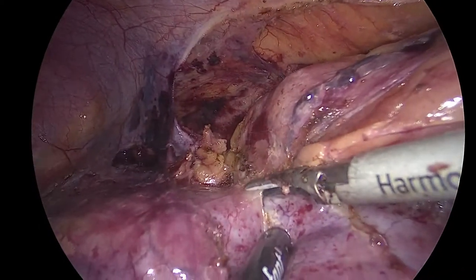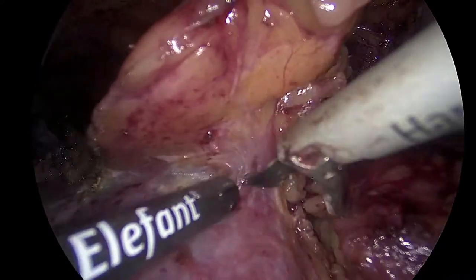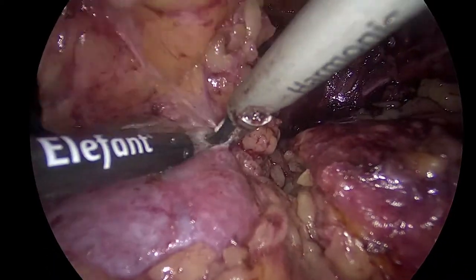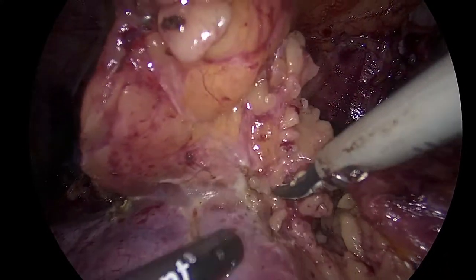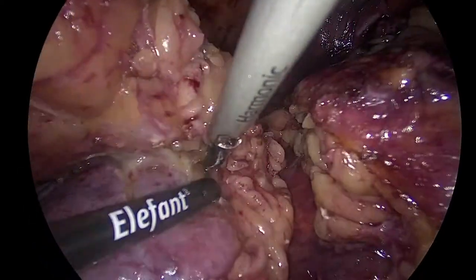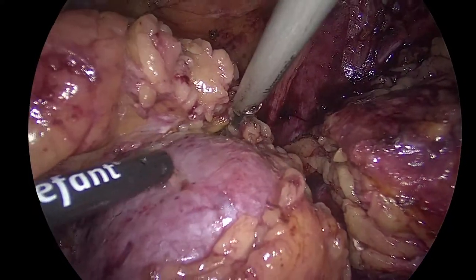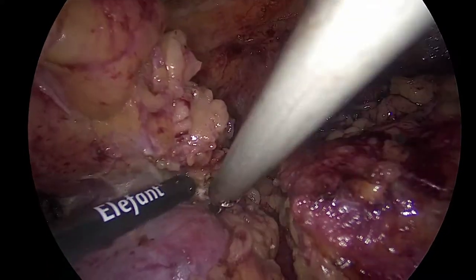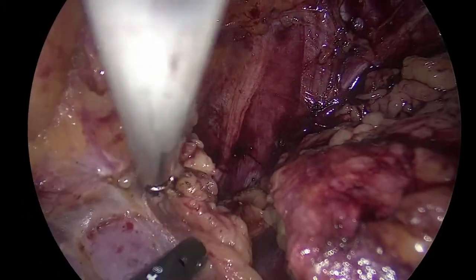Here, I've already started going. It's really very interesting. Watching you, how you use your left hand suction device, I love the suction device, and at home I have a metallic one, which is even more helpful than this. You don't need a grasper. It's amazing. No, I don't use a grasper in my left hand. My left hand, always in upper tract laparoscopy, is suction. Always. In prostate surgery, it's different.